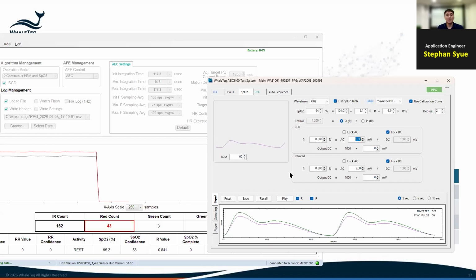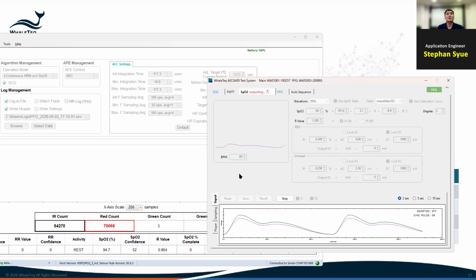And then let's decrease to 3 and 2.5. Now it's become even smaller, the amplitudes you can see. And when the amplitude gets small, the noise floor starts being dominant. So you can see some flaws in the waveform, but the backend can process that in the digital processing.